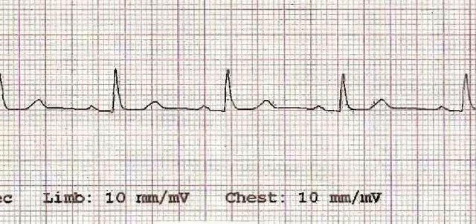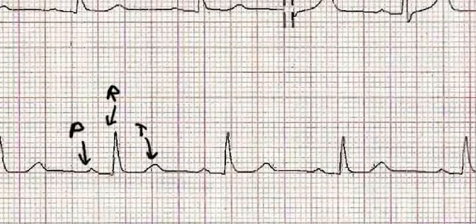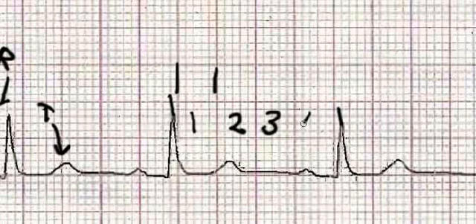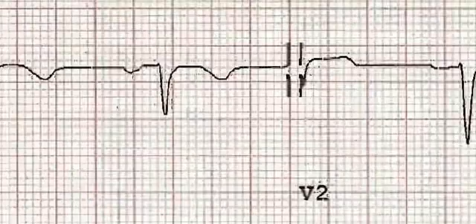Here we have an ECG which happens to be in sinus rhythm, and it shows a series of QRS complexes. Most ECG books tell you to calculate the rate by counting the number of big squares between two successive complexes — so from there to there. A big square is five millimeters. Counting here we get one, two, three, four big squares. Your average ECG book tells you to count the number of big squares and divide that number into 300.